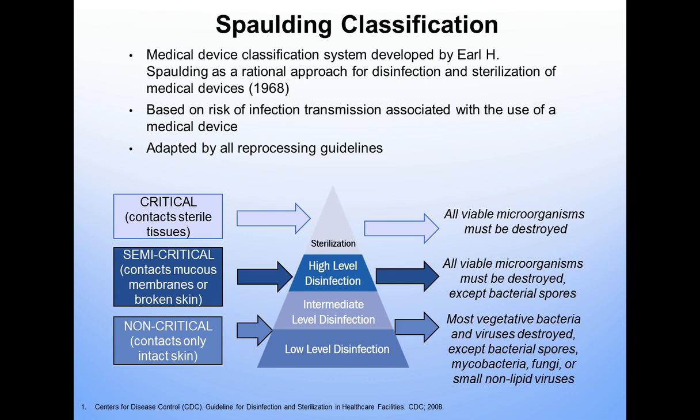And so if we do utilize ultrasound equipment in a critical area with the client, if it's in the perioperative area, the ultrasound probe must be sterilized. And that means, of course, all viable microorganisms must be destroyed through the sterilization process.